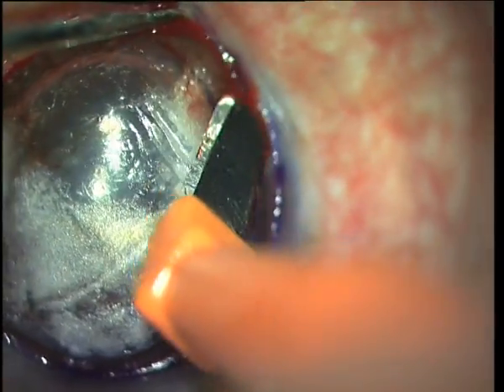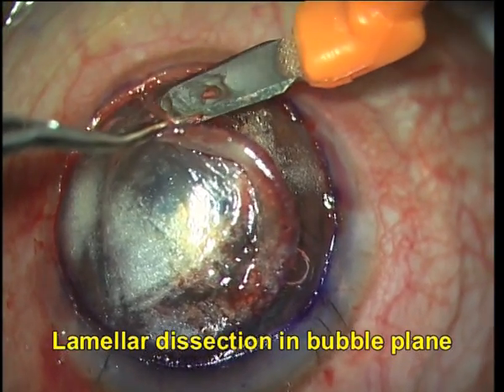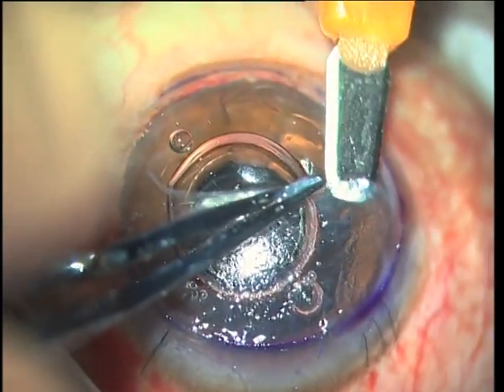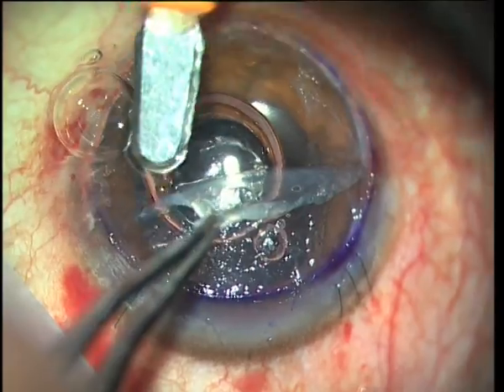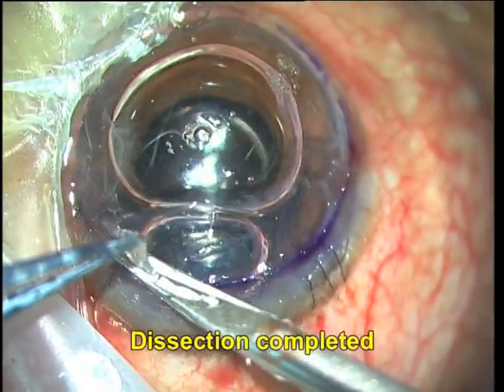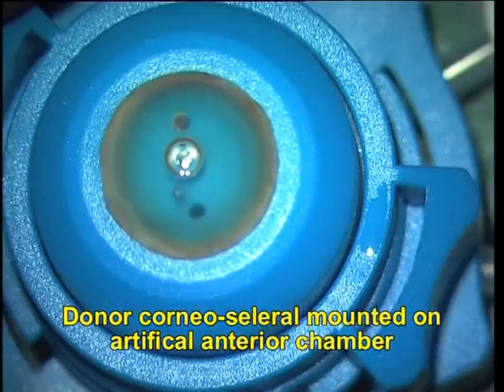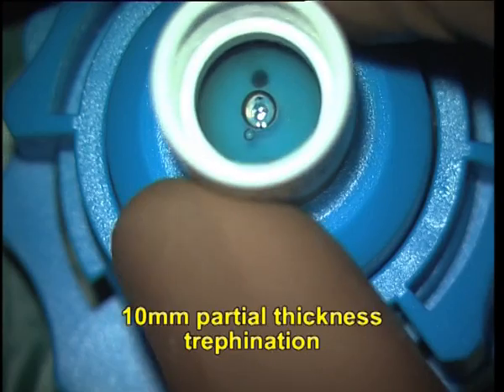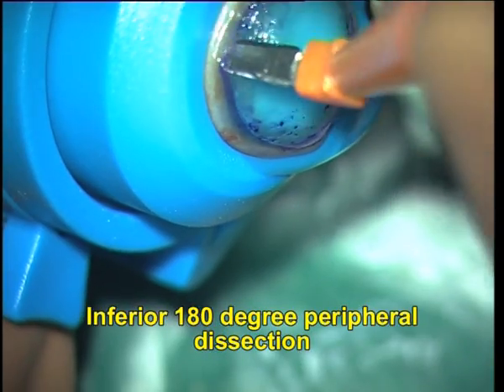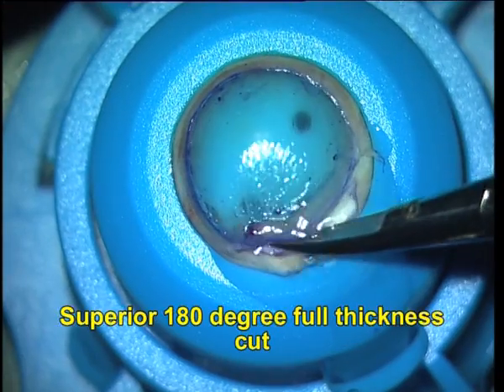This lamellar dissection extends throughout the inferior 180 degrees and can extend into the scleral zone as well. I now turn my attention back to the lamellar keratoplasty and I dissect the superficial stroma off using a blunt crescent blade, taking care at all times not to cause accidental perforation of the Descemet's membrane. Once the host cornea has been prepared, we turn our attention to the donor corneoscleral rim which I have mounted on an artificial anterior chamber. I use a 10 mm trephine to create a partial thickness trephination and then perform an inferior 180-degree peripheral lamella dissection.